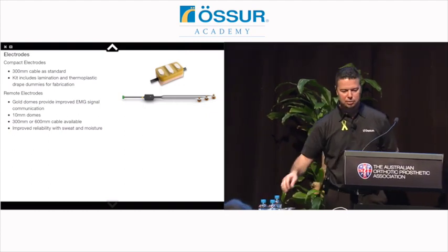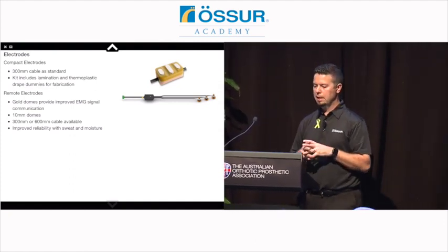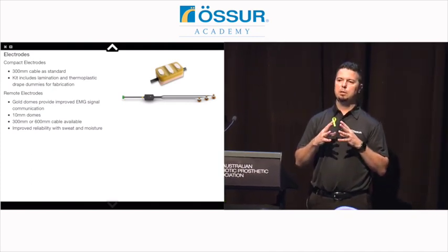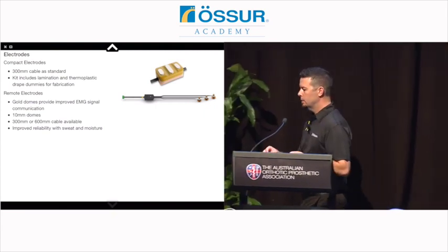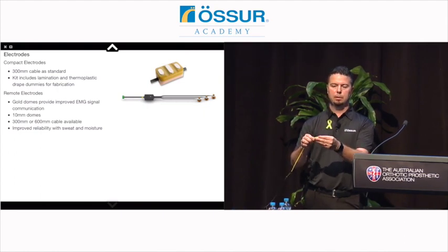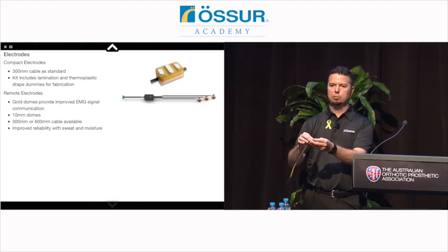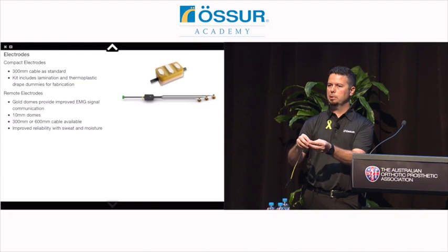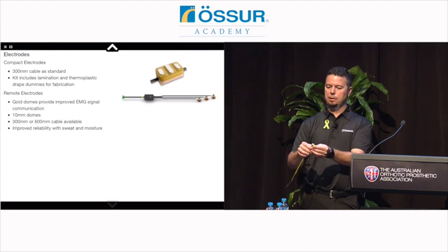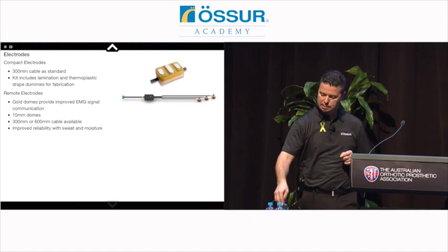And then we also have remote electrodes, and remote electrodes move the filtering and amplification downstream from where the contact is on the skin. And the advantage there is if you have somebody that perspires a lot, with this kind of electrode, if you've ever fit this kind of electrode on anybody, I don't care who it is, even if they're a petite little female, eventually perspiration and moisture gets back in there and can corrode and ruin that connection, so you have to replace it. The remote electrodes are immune to that because you're only dealing with contact points. You don't have any circuitry right up against the skin. So it's a nice option.